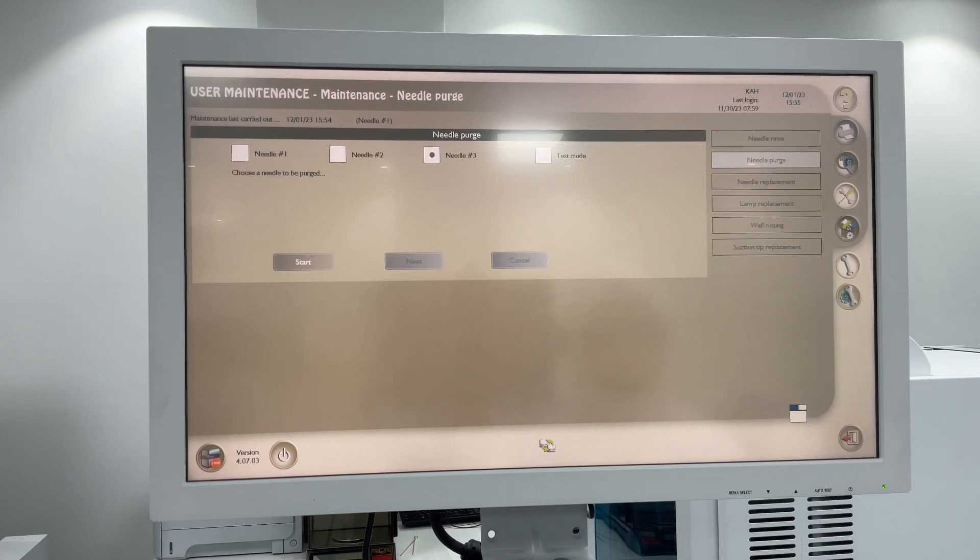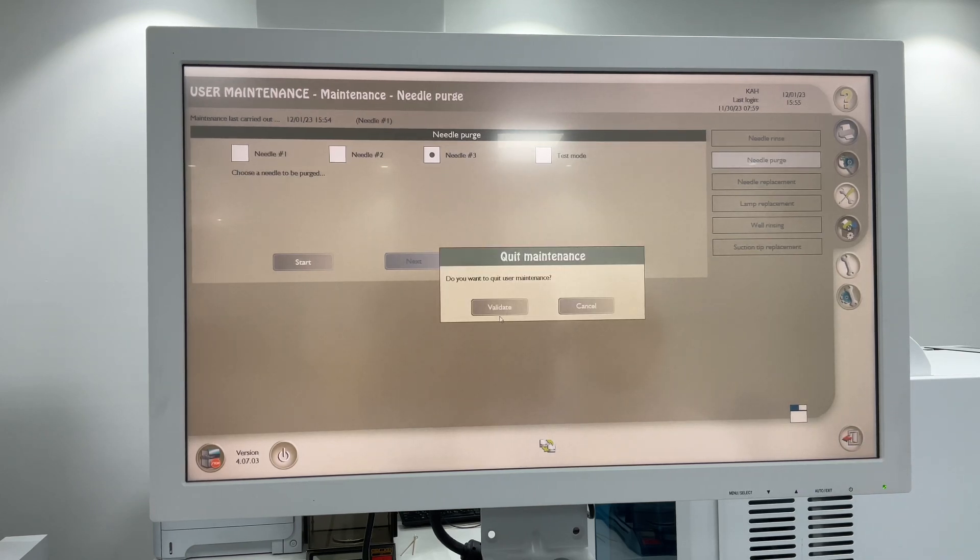After all the maintenance is done, click Return, then Validate.